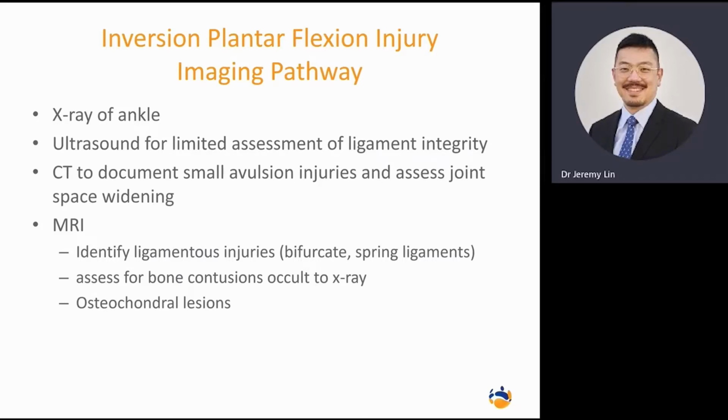CT can help to look for avulsion fractures that may not be readily apparent on X-ray. And this also helps if there is any joint space widening or subluxation of the Chopart joints, which will indicate to us that there is an underlying ligamentous injury.